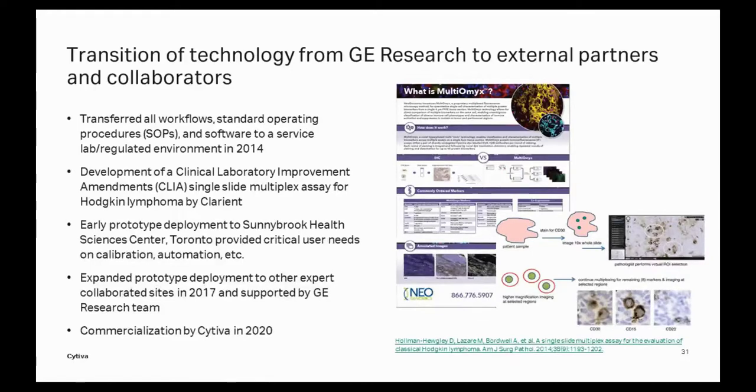And they then took it from there, and they developed a Clinical Laboratory Improvement Amendment, CLIA assay for Hodgkin lymphoma, published that work, and showed that the single cell multiplexing workflow compared extremely well with the pathologist review of a single slide analysis of Hodgkin lymphoma.